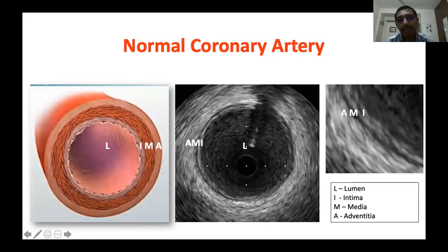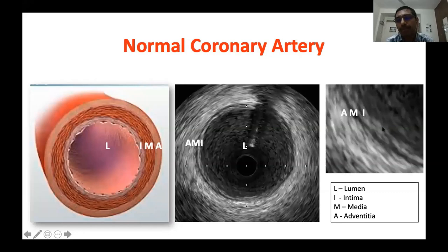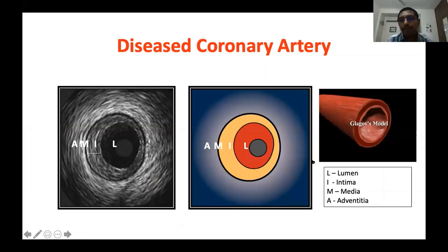Then comes the three-layered vessel wall architecture. The inner layer is the intima, which is rich in collagen and elastin, so it reflects sound intensely — this layer appears bright. The second layer is the media, mainly made up of smooth muscles, which doesn't reflect sound well — so it appears dark. This forms the bright inner layer (intima), darker middle layer (media), and outer bright layer (adventitia). So bright-dark-bright is the normal appearance of the vessel wall on IVUS imaging.